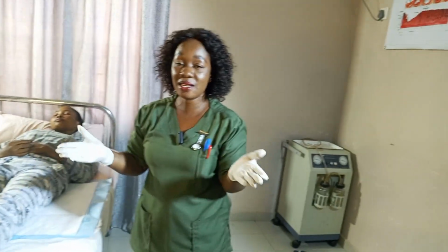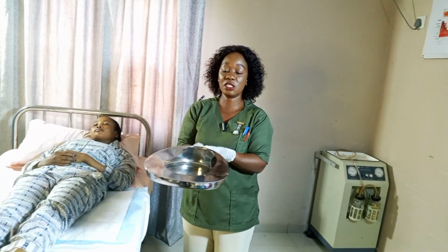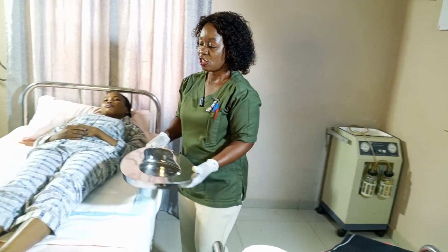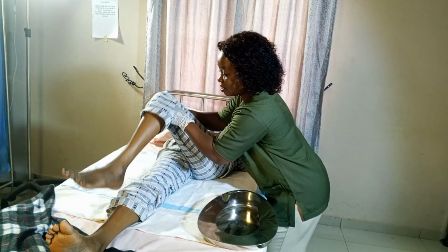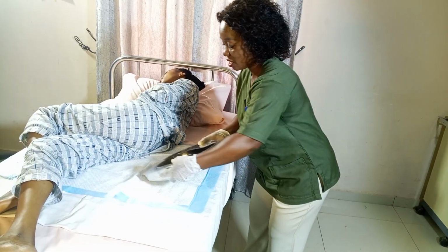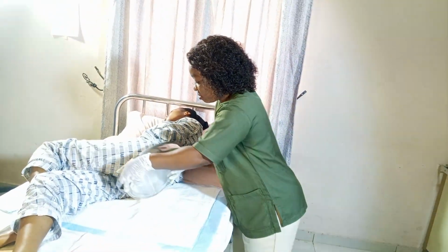The next thing is for me now to offer the patient the bedpan. So I pick up my bedpan, and if you're holding the bedpan, you hold it this way, right? You hold it by the handle. If you're using this, you hold it this way, and then you serve the bedpan to your patient. So again, I'm going to assist my patient to flex her leg this way, right? Then I will turn the patient this way, and I will not place it this way, rather you place it under the patient's buttocks using this edge, and you place it right.